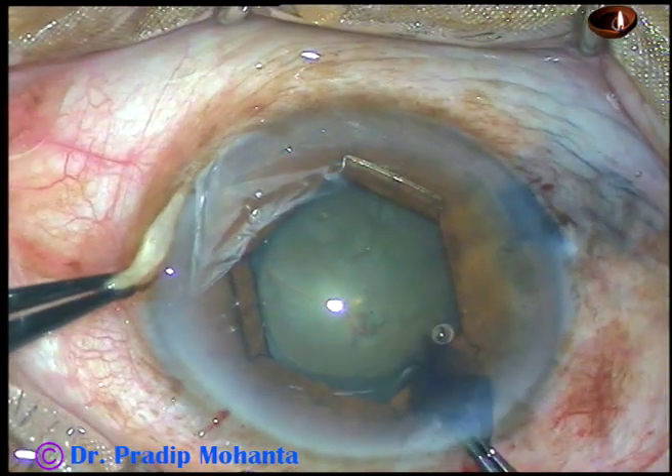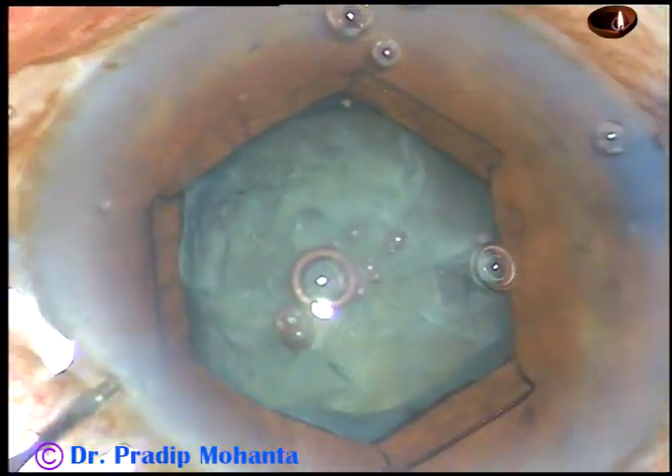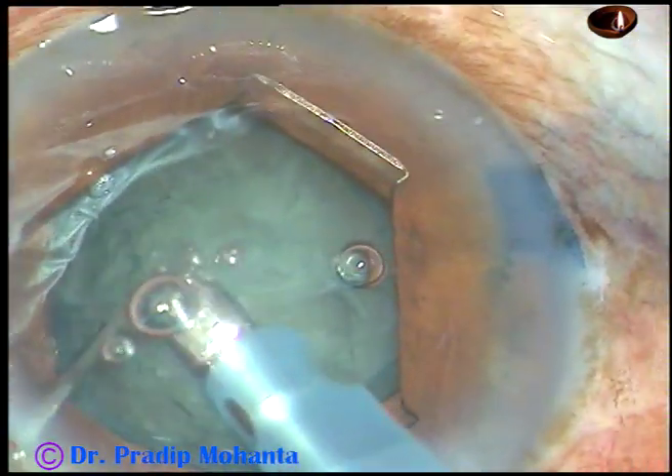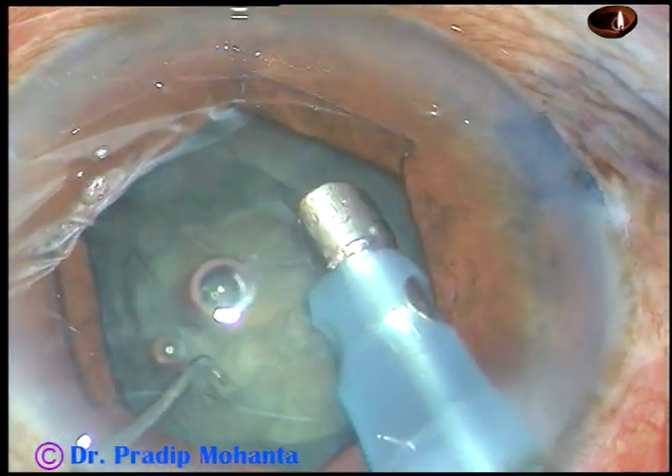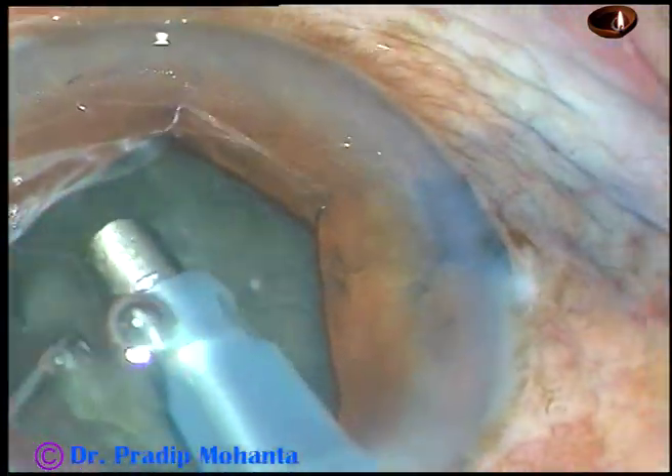After rhexis, hydrodissection is done and then the nucleus is managed. I usually do direct chop. This is a cataract with grade 3 nuclear sclerosis.